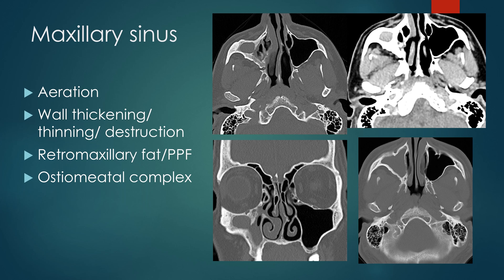When discussing the sinus, you evaluate the degree of aeration. This left maxillary sinus is well aerated. The right maxillary sinus is opacified with soft tissue density material. There's associated bony wall thickening, which usually is related to chronic sinusitis. You will also evaluate the sinus for wall thinning with a process such as a mucocele, which opacifies and expands the sinus, or bone destruction, which suggests a more aggressive process. This is a completely opacified sinus with chronic bony wall thickening, suggesting a chronic sinusitis process.